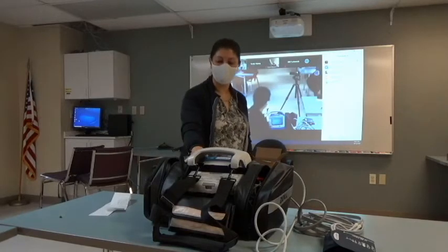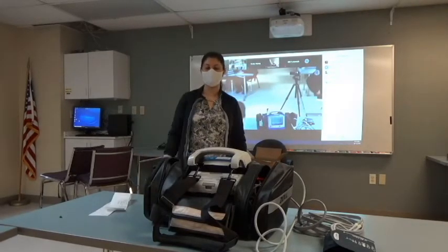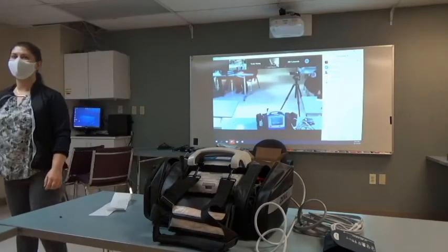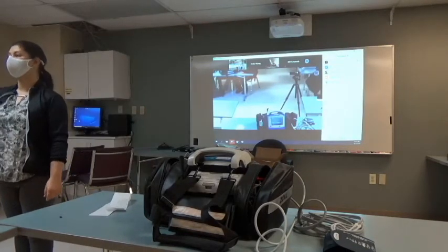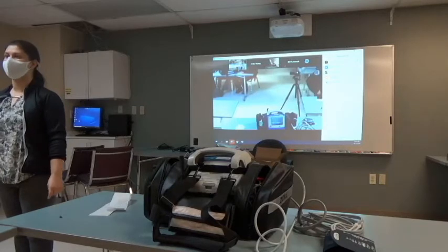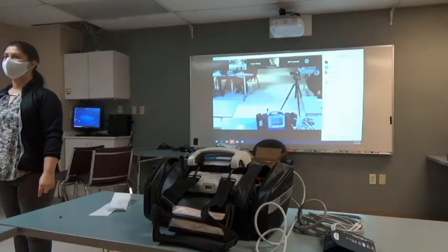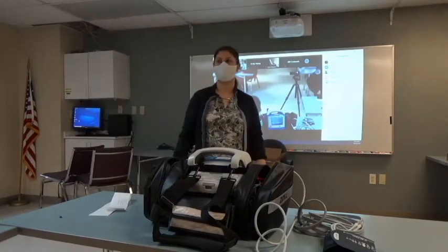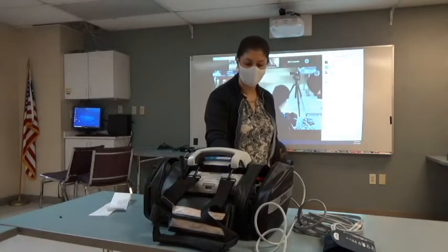Okay, we're going to go ahead and hit our home button. I'm going to show you how to send it to the cloud so you can get it into your EPCR. Do you all see the envelope? Go ahead and press the envelope.